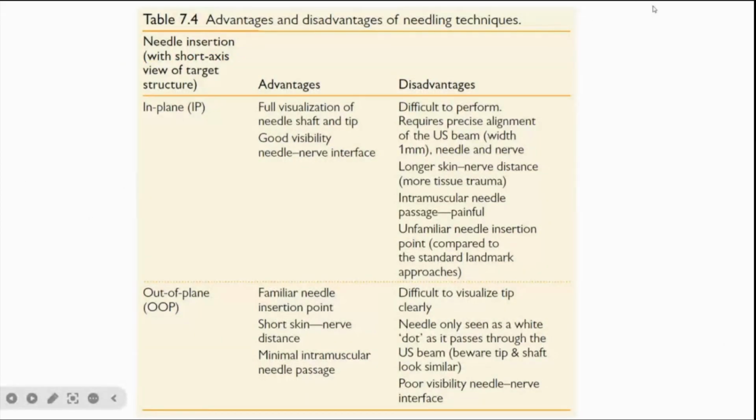So this is a table to compare the in-plane and out-of-plane techniques and their respective pros and cons. For the in-plane technique, it allows full visualization of the needle shaft and the tip, and it has good visibility of the nerve-needle interface. But it is difficult to perform, and it requires a precise alignment of the ultrasound beam.